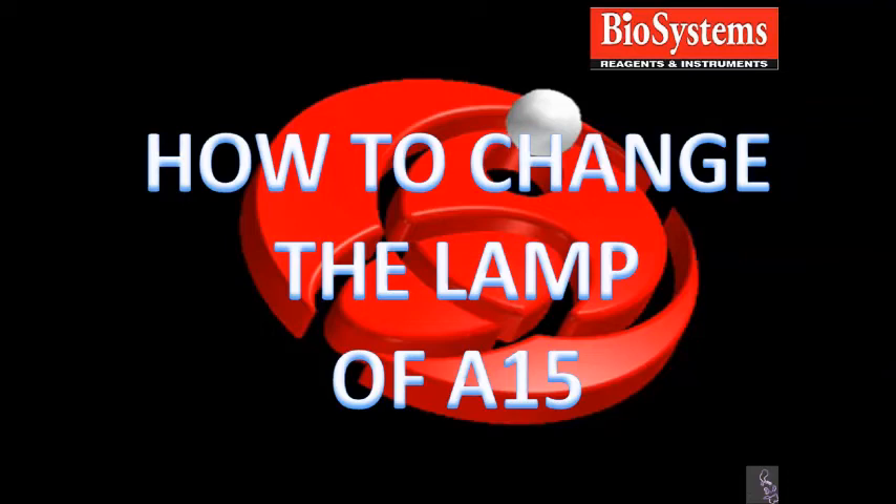How to properly change the lamp of the A15 analyzer. This is to make sure that you obtain accurate results at the maximum performance of the lamp.